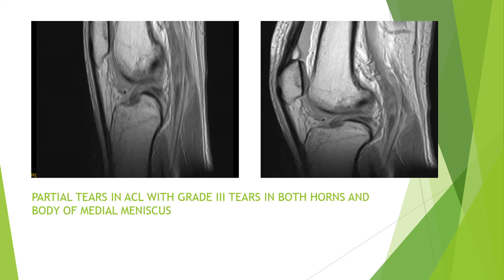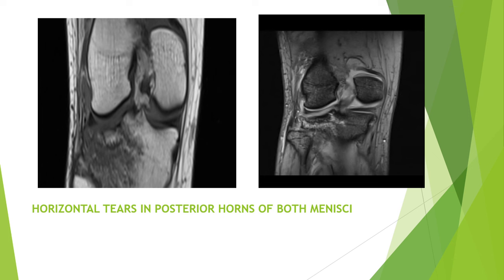These are T1 and T2 weighted images in the sagittal plane showing partial tears in the ACL — anterior cruciate ligament — with grade 3 tears in both horns and body of the medial meniscus. These are T1 and STIR images in the coronal plane showing horizontal tears in the posterior horns of both menisci.